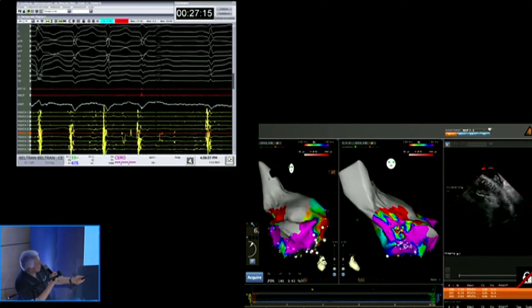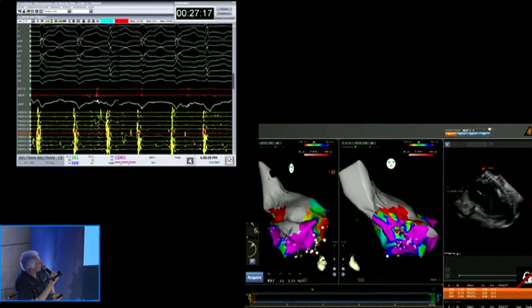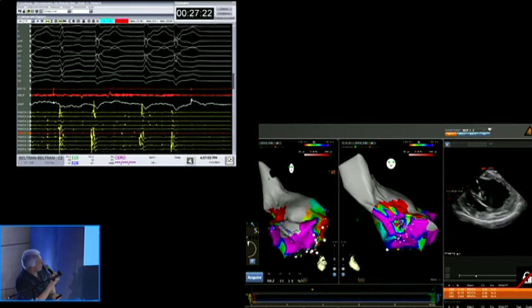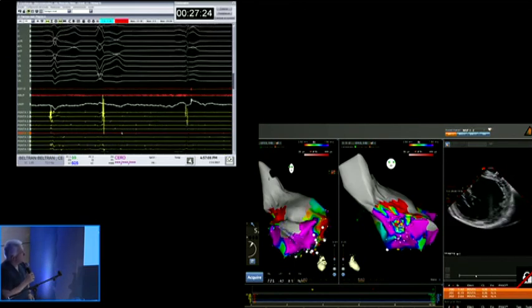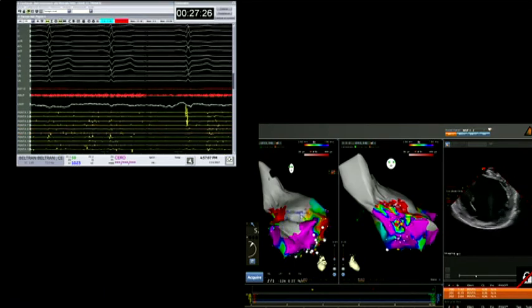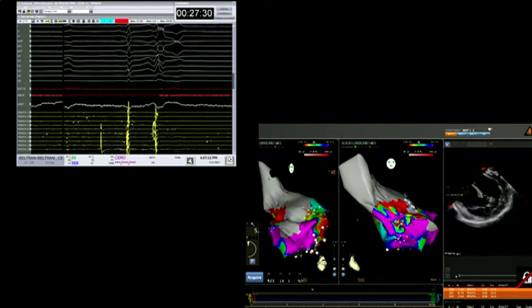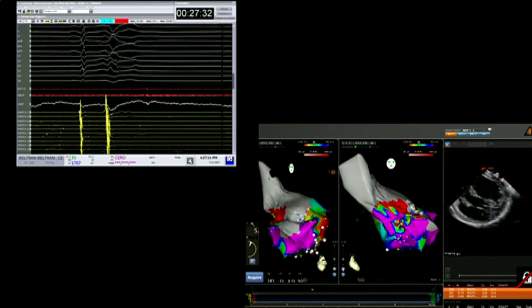Are you on the septum now? Septum or apical now? Show me a left lateral view. It does help sometimes also in VF storm with normal heart because it gives you less likely to cause PVC and gives you a lot of information.